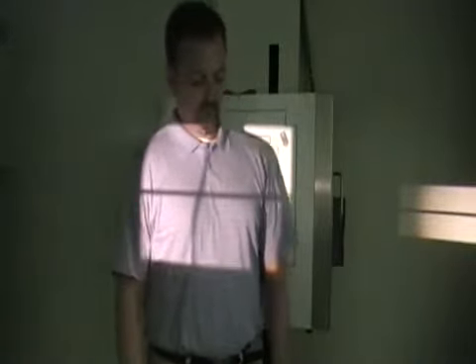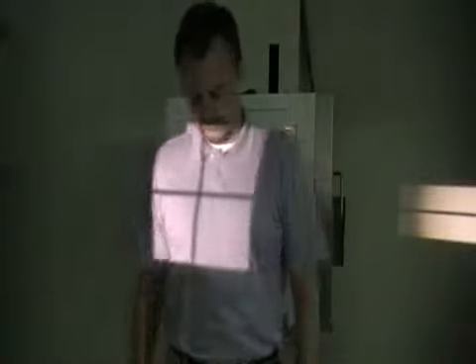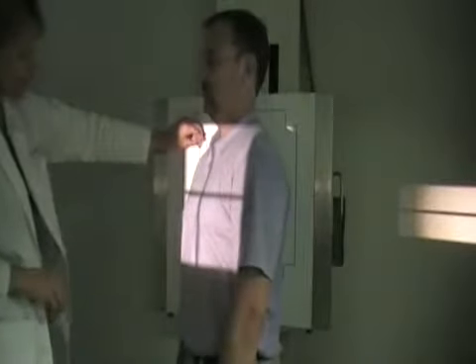So with your chest oblique, being this is the left oblique, you're going to use your left marker to mark the side touching. You're going to ask the patient also to do this on deep inspiration. So again, we're going to ask them to take in 2 deep breaths and then hold that. For the right oblique, have your patient 45 degrees. Right side is touching. We're going to place our right marker up against here.